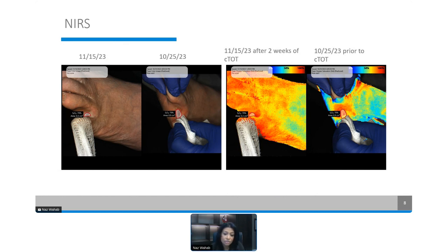That oxygen gradient is also probably recruiting more cell signaling and recruiting cells to the area to complete closure of the wound. So it's a very interesting observation that occurred just incidentally while we were taking these images.